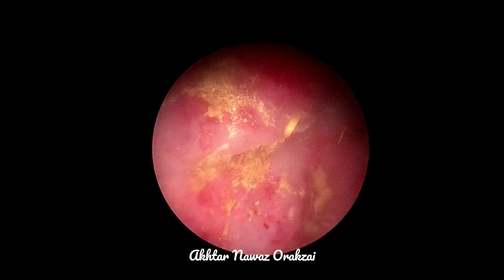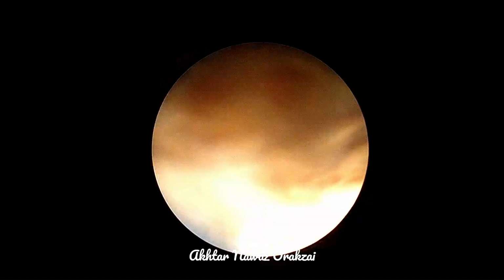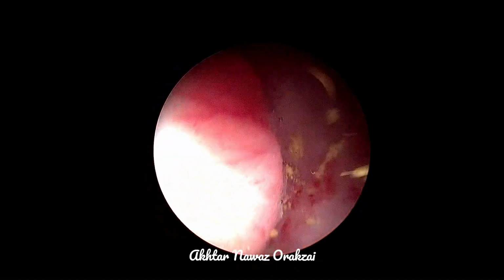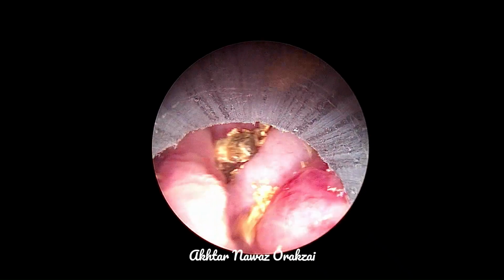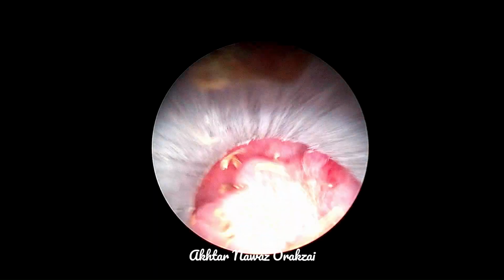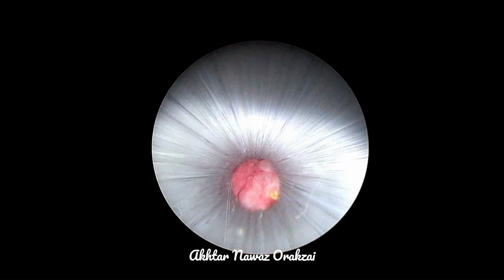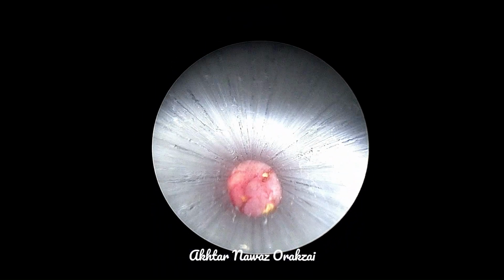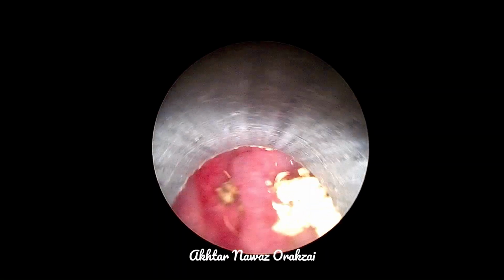There is some slough lying here and there. You can see the median and the lateral lobes of the prostate as well. And then we'll place a perurethral catheter under vision, and that will be it.